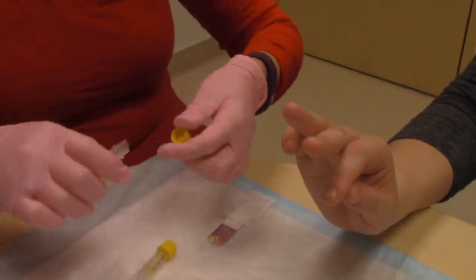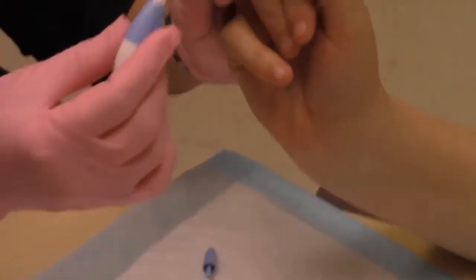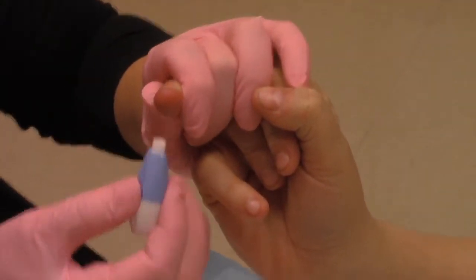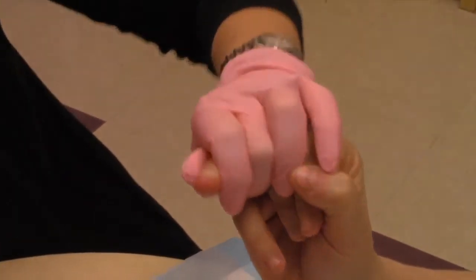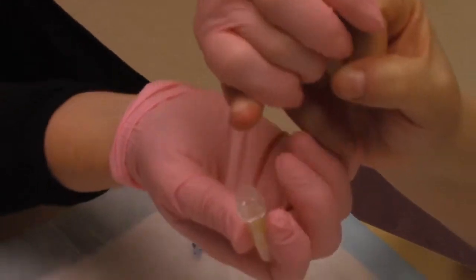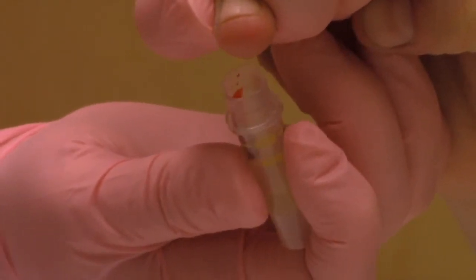Uncap the tubes and place them close by. Pull the cap off the lancet and press the lancet against the outside of the fingertip like so. The lancet is pressure activated so once you have pressed the poker against the finger hard enough the lancet will be released for the poke. You will hear a click once it has been activated.